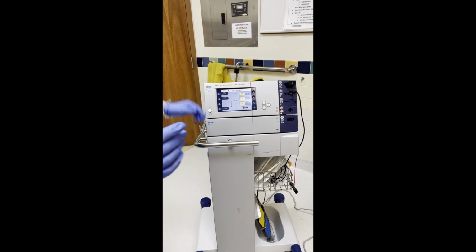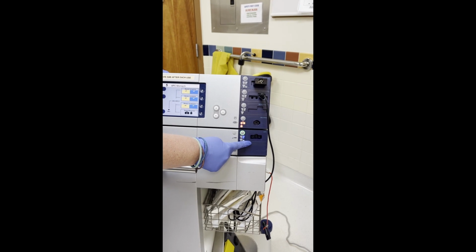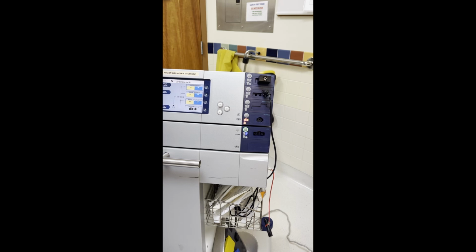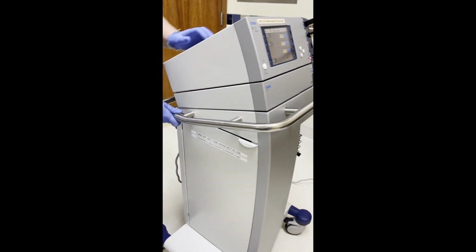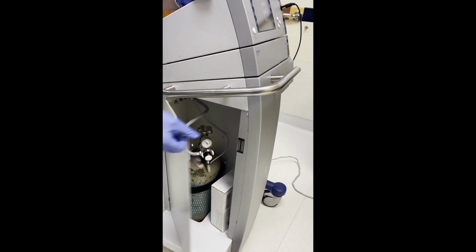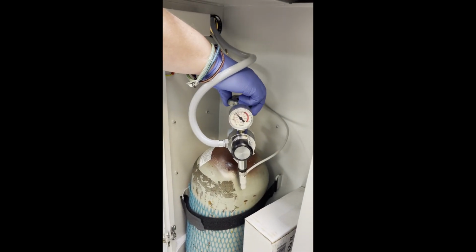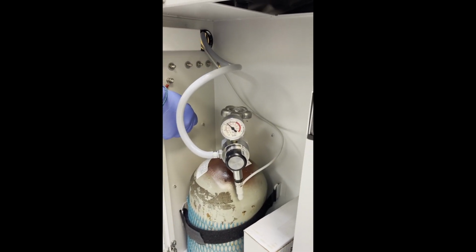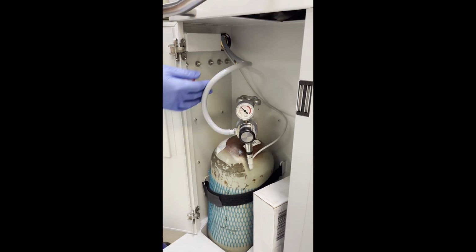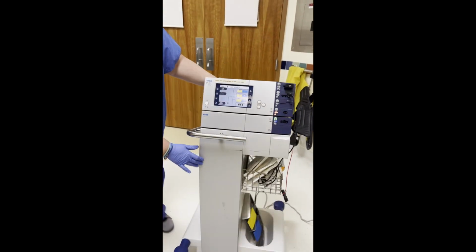So for APC, argon plasma coagulation, on the side is our tank with our argon gas. With APC only, you need to open this up, turn this on all the way to the top, and then shut it back, and then you can do your procedure.